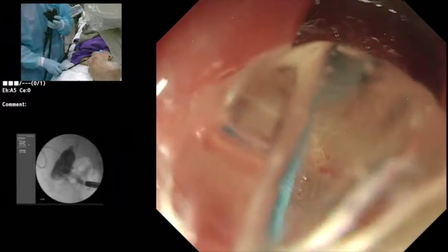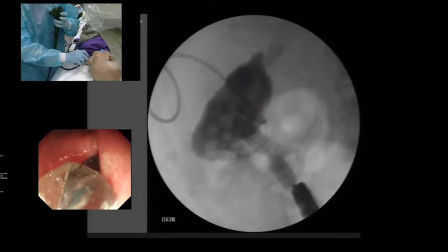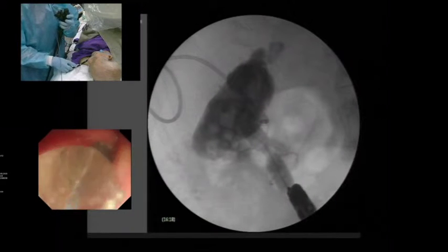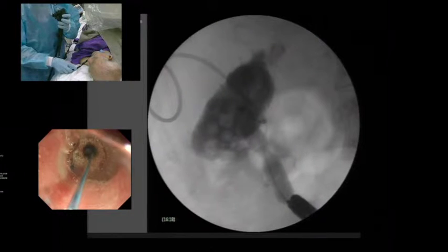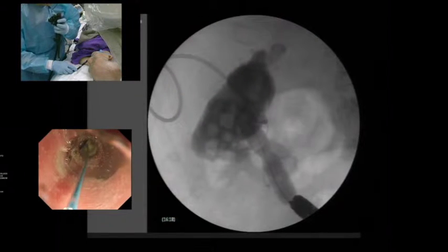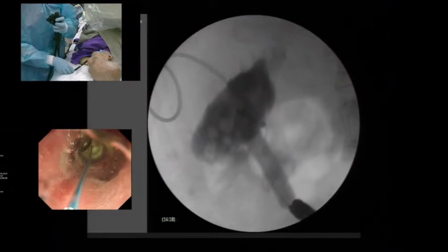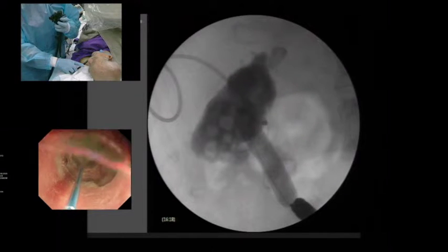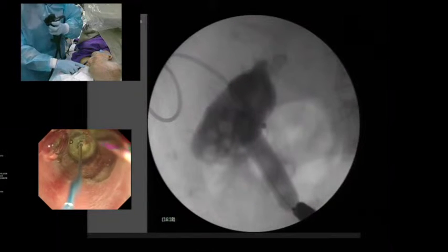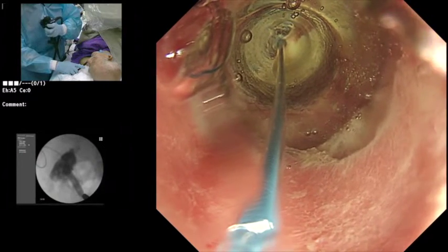So I've been able to stabilize, and I can even advance a little bit and push myself up against the balloon and look through the balloon, and you do that by just giving some water. There, the balloon's all the way up. Beautiful. So it's dilated, go back down. Oh, you can go ahead and go up then, continue. So you can do all of this under endoscopic guidance very nicely. Okay. So now we're at 15, go down.